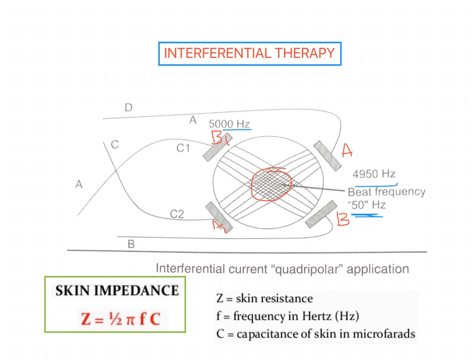We can use a constant mode or a rhythmic mode. A rhythmic mode indicates that the frequency is swinging continuously from the lower to the higher value and back. The frequency scales usually available are 1 to 100 hertz, which is constant mode, where any particular fixed frequency can be chosen.